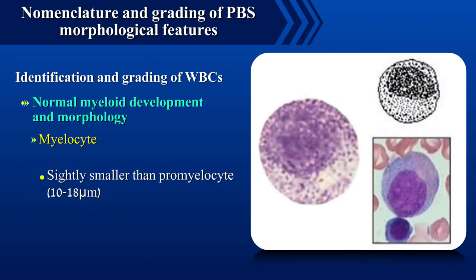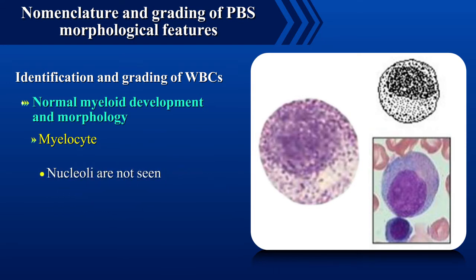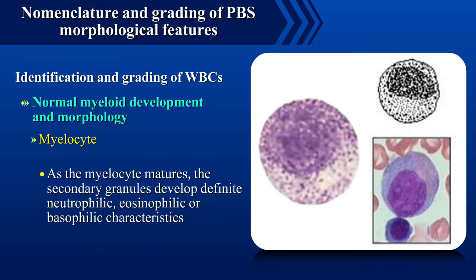Myelocyte is slightly smaller than promyelocyte with a diameter of approximately 10 to 18 microns with a round to oval nucleus which may be eccentrically placed. The nuclear chromatin shows a moderate degree of coarse clumping and nucleoli are not seen. There is a moderate amount of blue to pink cytoplasm which contains numerous red to violet granules. As the myelocyte matures, the secondary granules develop definite neutrophilic, eosinophilic or basophilic characteristics.